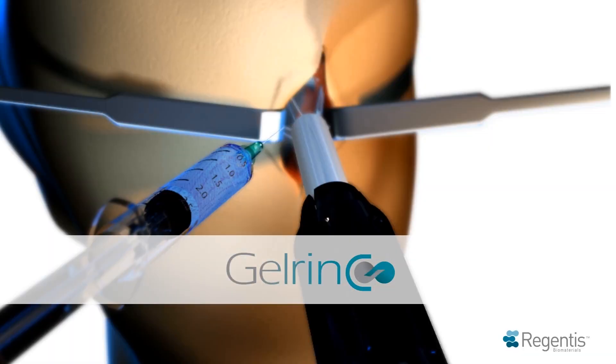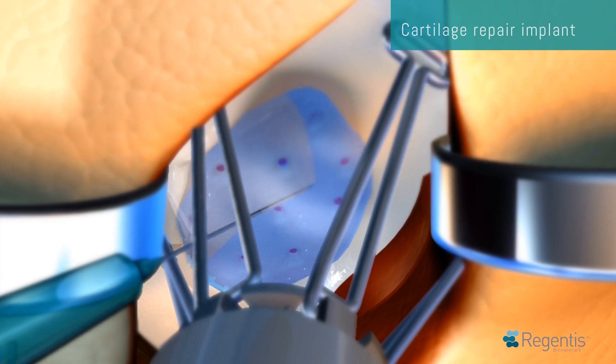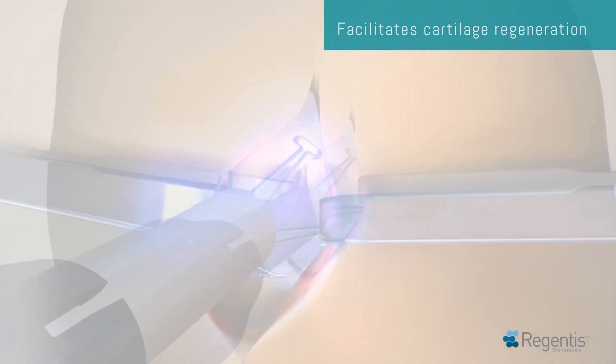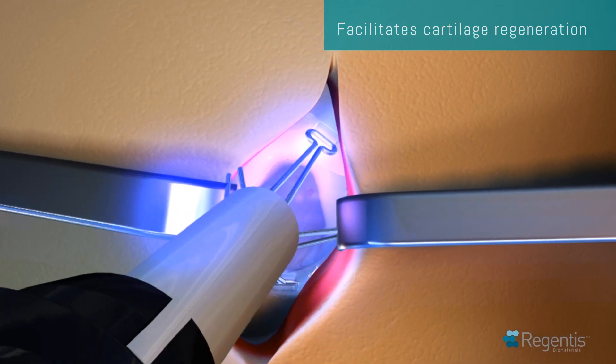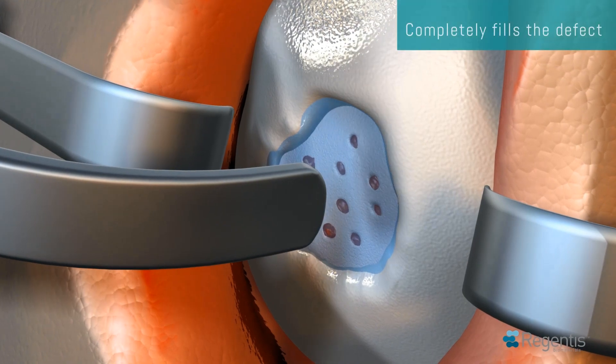Gelrin-C is an implant for cartilage repair designed to facilitate the regeneration of healthy cartilage. Gelrin-C, implanted after standard microfracture, is a soft, transparent, solid implant that completely fills the defect.